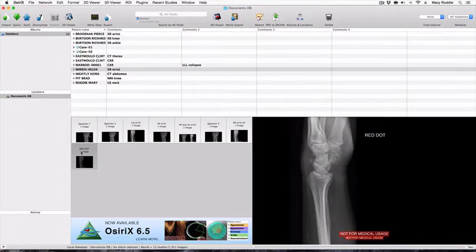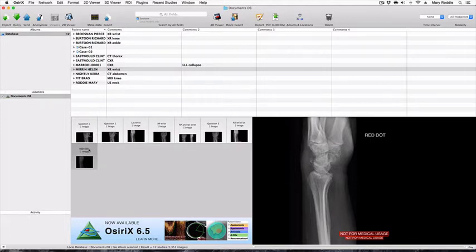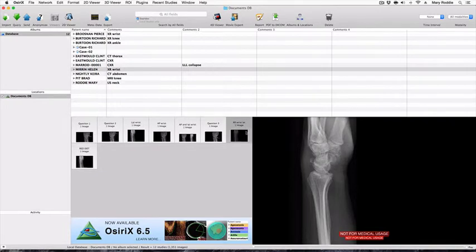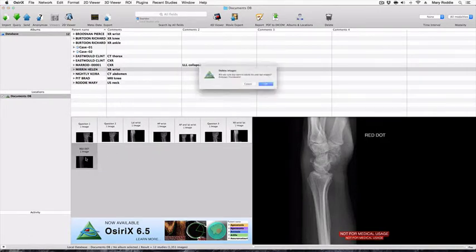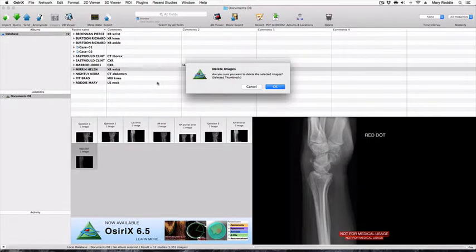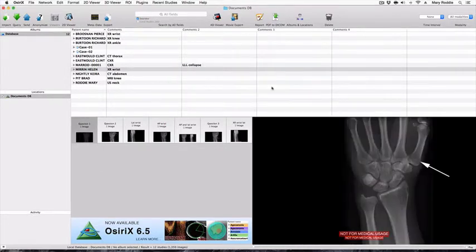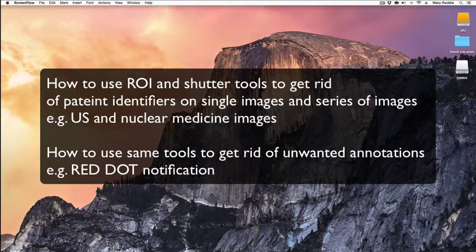If we now take a look at the database window, we'll see that in addition to the original image that had the red dot sign on it, we have a new cleaned up image and we can simply delete the original by backspacing and pressing delete.